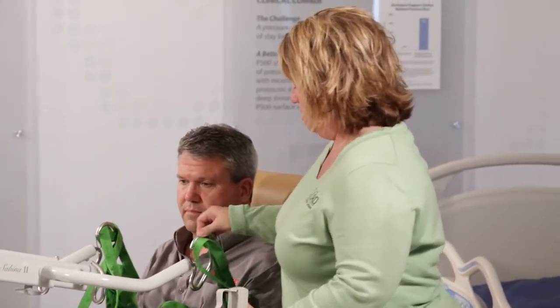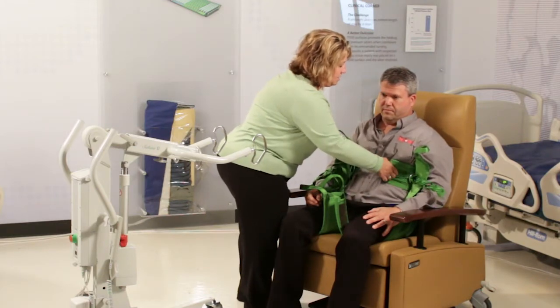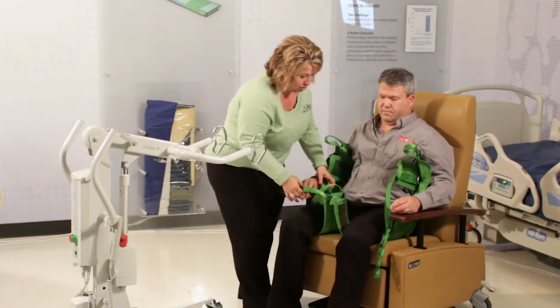Then you just unhook them and push this out of the way. What's great is you're not sitting on our slings, so we can easily take it off and you don't have to keep it behind you when you're in your chair all day long.